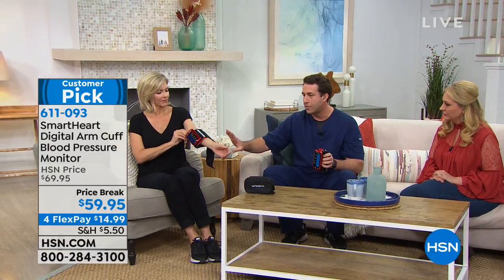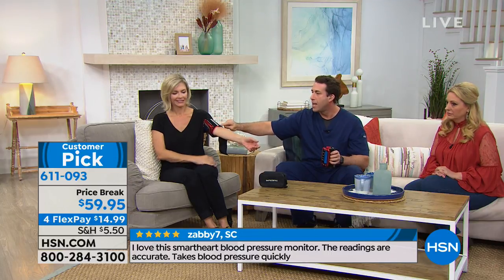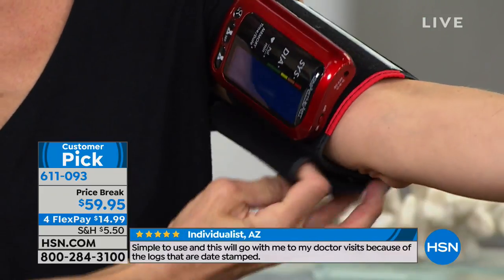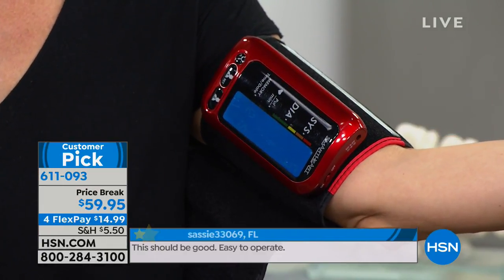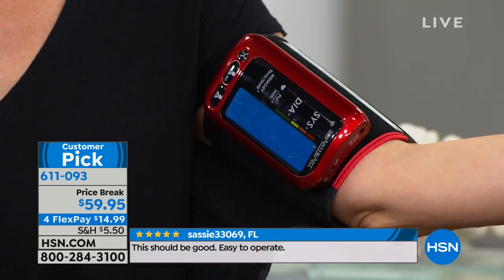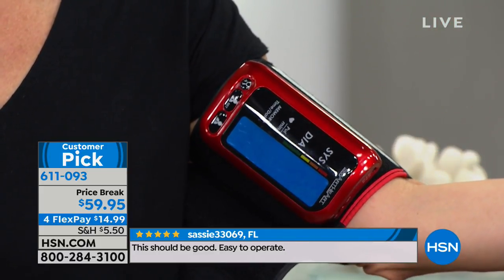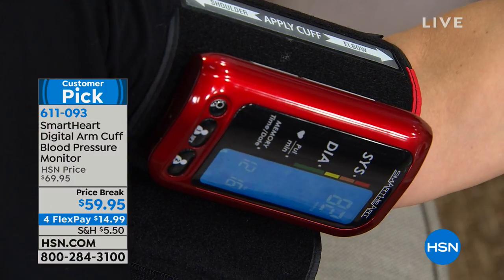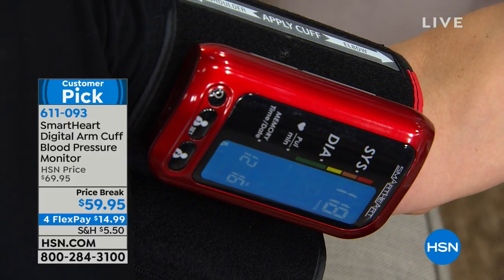It is an arm cuff, not a wrist cuff — so you have that arm cuff, and it's attached. It's going to tell you exactly where to place this. It's a latex-free cuff simply with a hook and loop enclosure. One button is going to get you started. What's neat and unique among blood pressure units is that it's attached, it's tubeless, and you see those memory banks — press either one or two, and it's going to store your reading in that memory bank. Up to 250 readings for each of two users, 500 total.